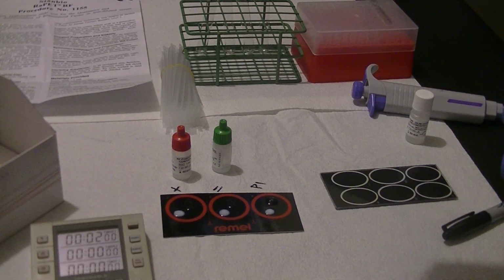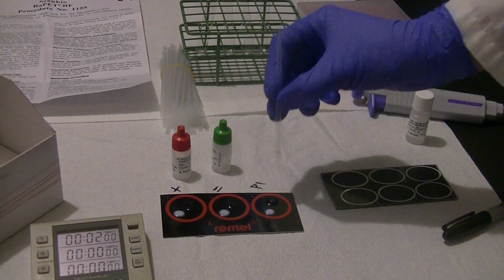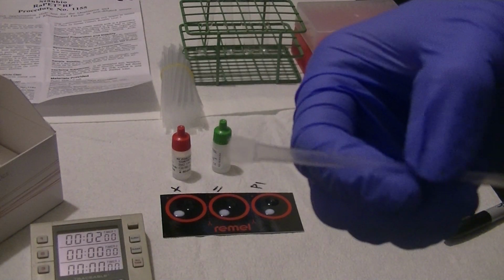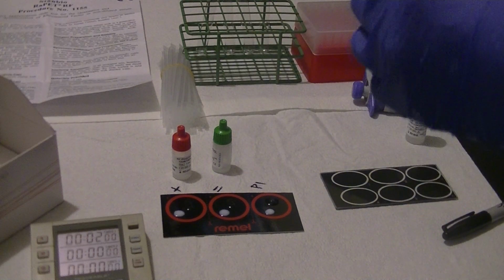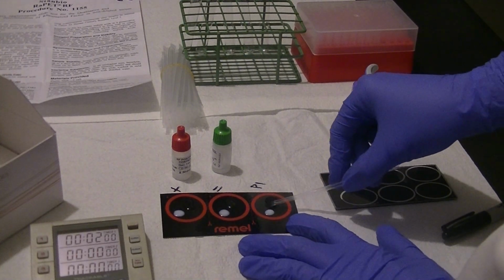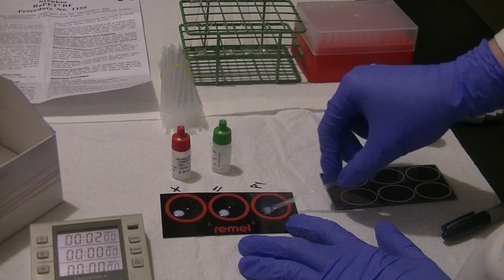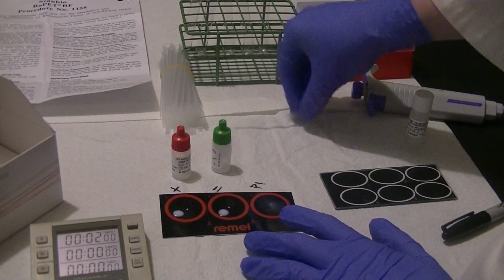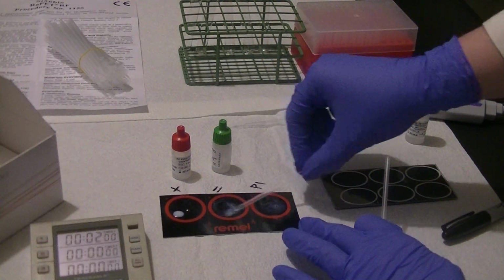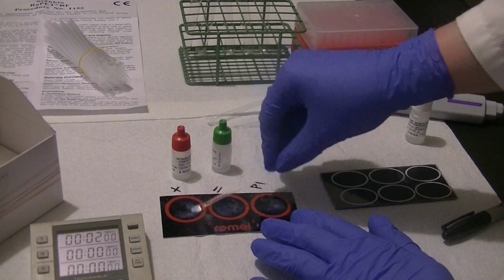The other end of this stick is flattened, and that's because we can dispense patient sample with one end and then stir with the other end. So these are known as dispensers. So the next thing I'm going to do is mix together the drop of latex particles on one side of the reaction circle and the patient sample on the other side of the reaction circle. I'm going to use a separate dispenser to mix together the negative control with the latex particles and the positive control with the latex particles.